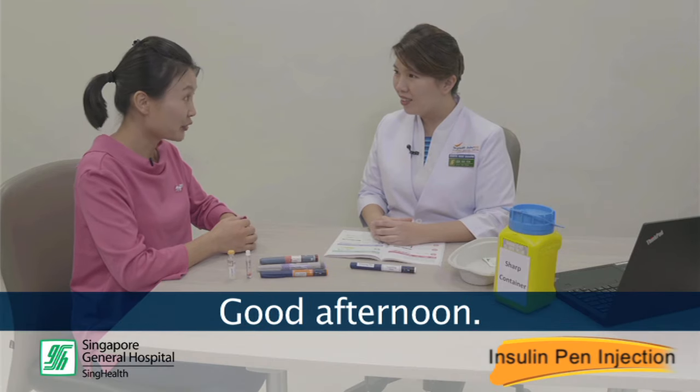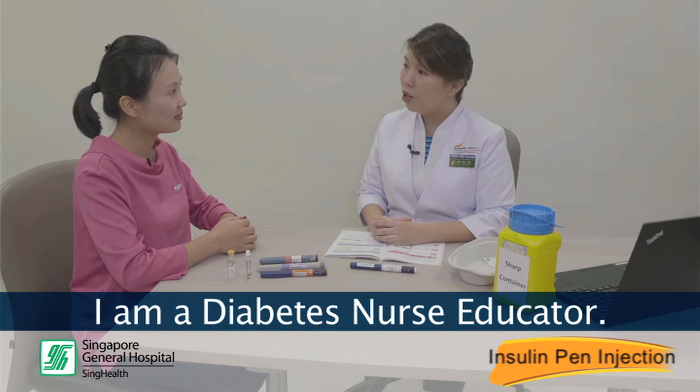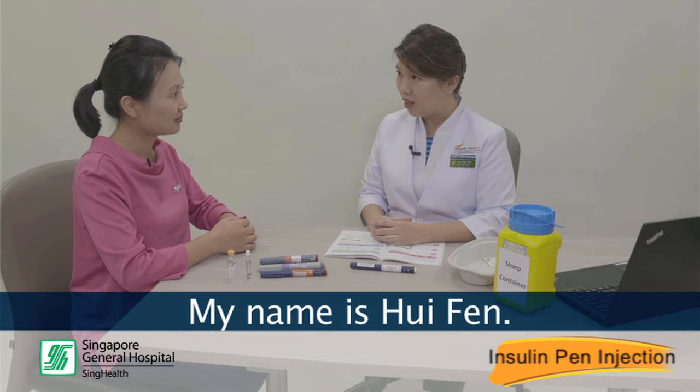Good afternoon, Ms. Grace. Good afternoon. I am a diabetes nurse educator. My name is Hui Feng. Dr. David has prescribed you a once-daily insulin injection to help your glucose control improve.